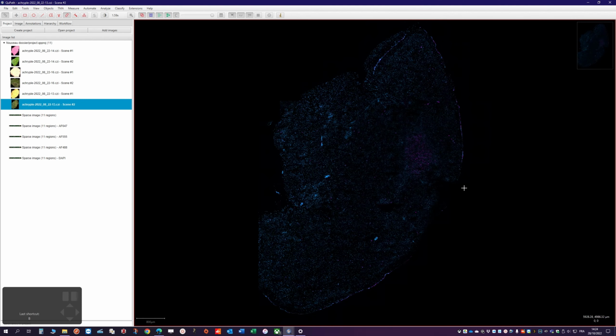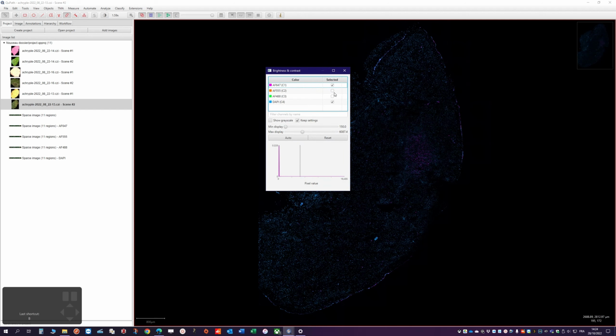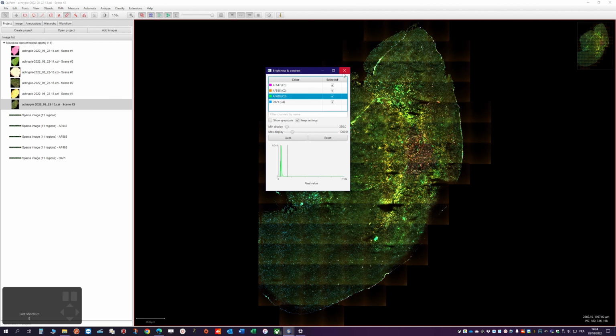Okay, so now we are done. We can test this properly. To do this, let's open up the last image here, which we haven't seen yet. It's okay, yes. And let me just display all the channels.